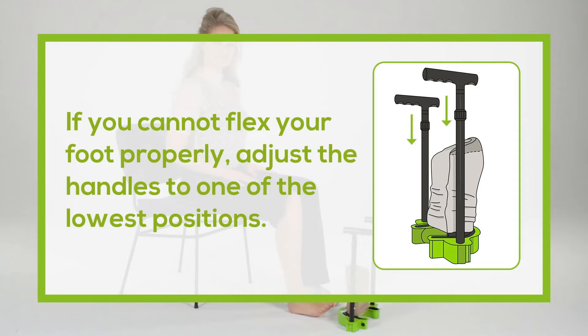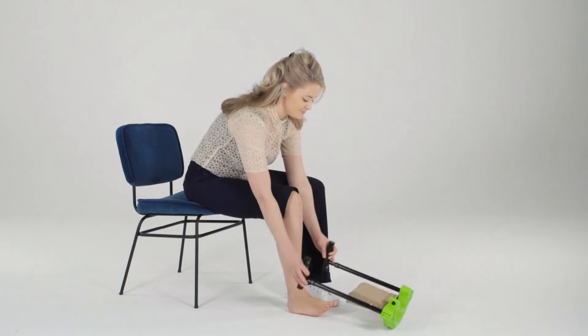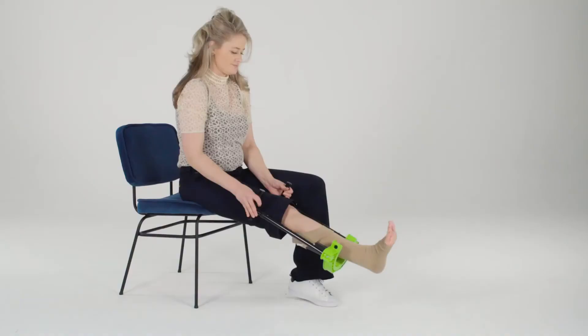Sit in a low chair so you can tilt the Steve Plus really low down. Insert your foot fully into the stocking and pull the Steve Plus up slowly along your leg with back and forth movements. This way the stocking can easily unroll around your leg and does not stretch too much.